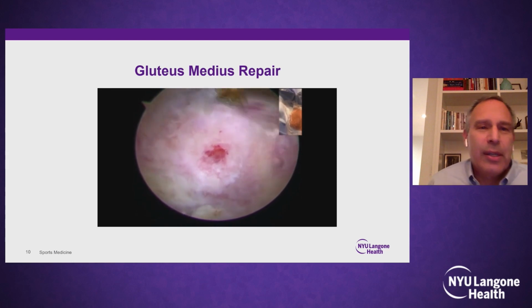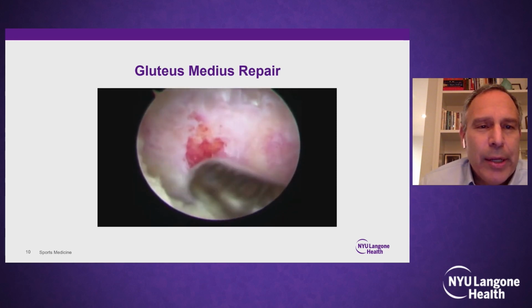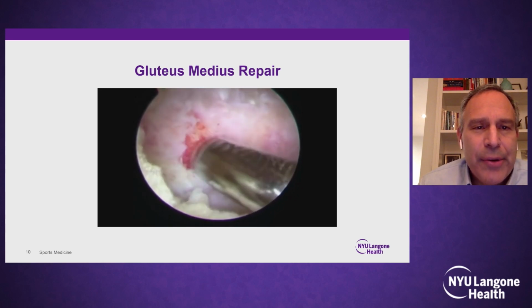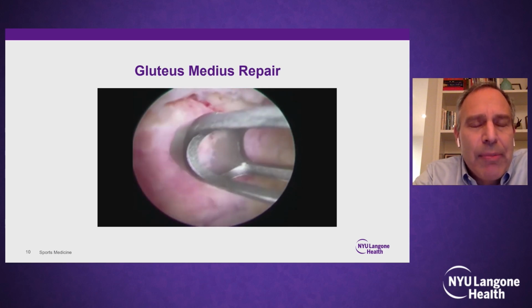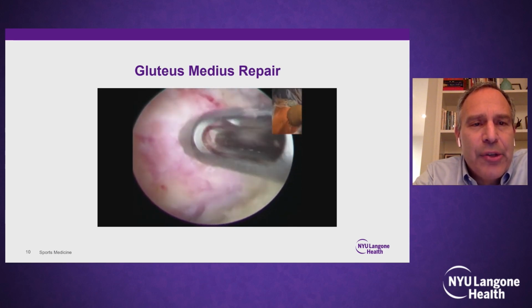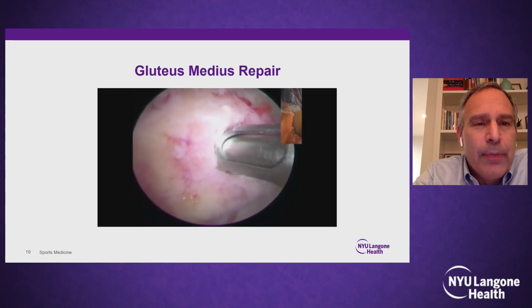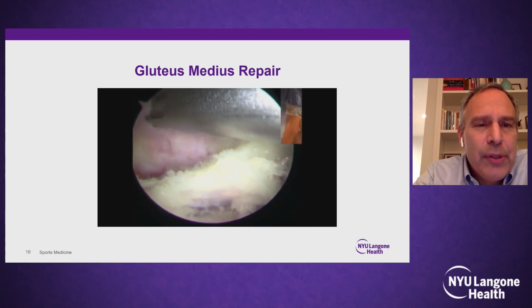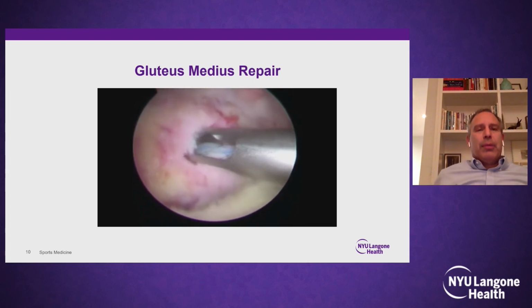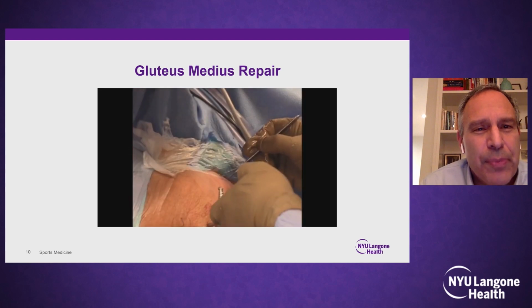I think in this case, I'm not sure doing a knotless repair would be the way to go. I would still probably put your anchor in and then start using either suture type lassos or bird beaks to get your sutures. This is a 2.8 all suture anchor. Again, a 72-year-old, these suture only anchors are pretty strong. And these are double loaded anchors with non-absorbable sutures.